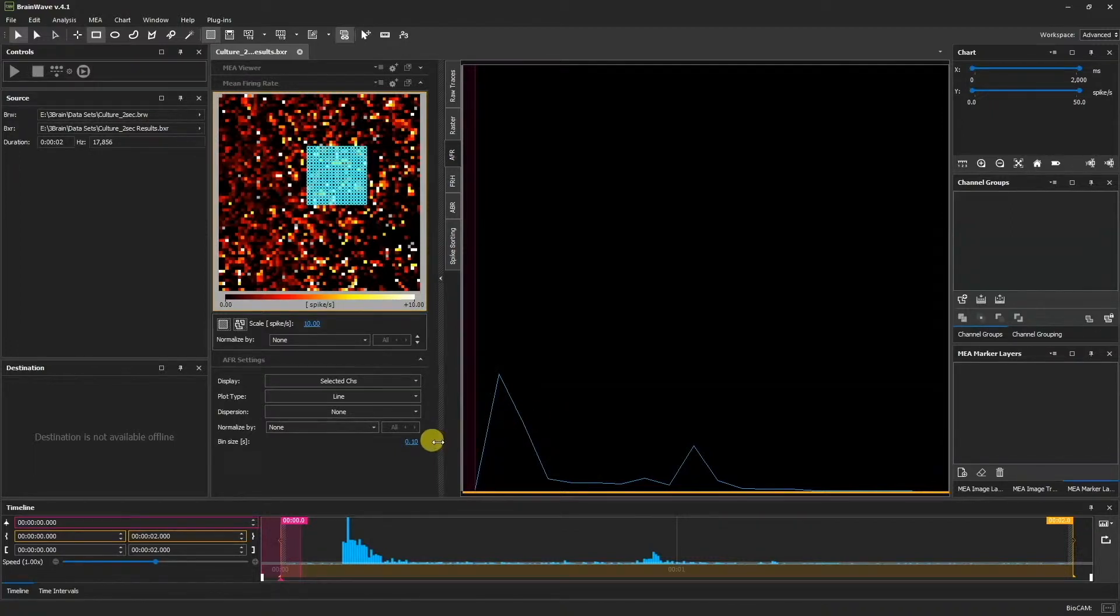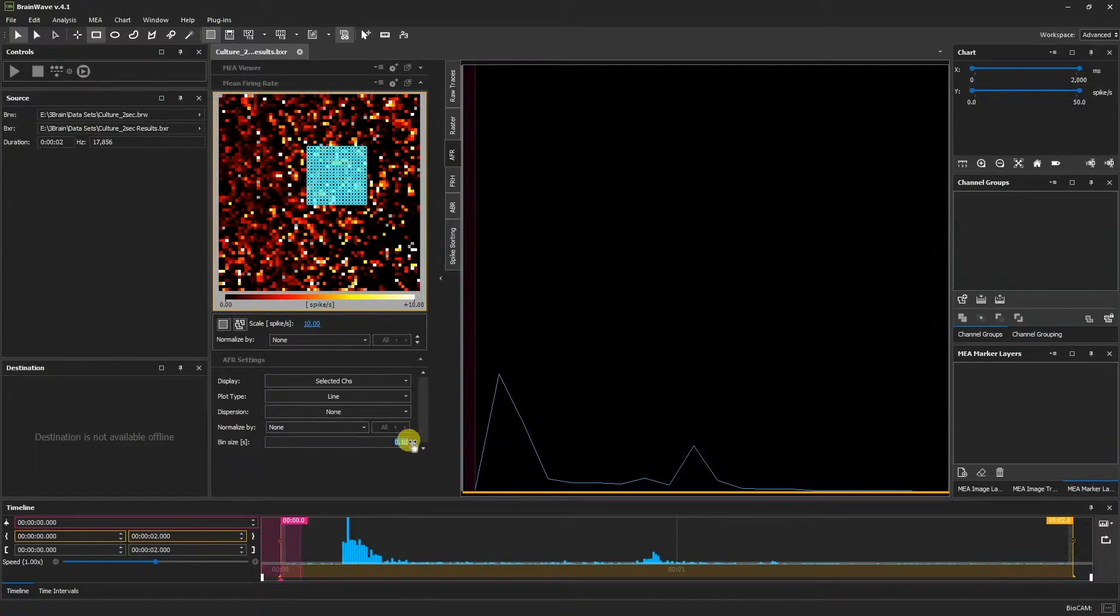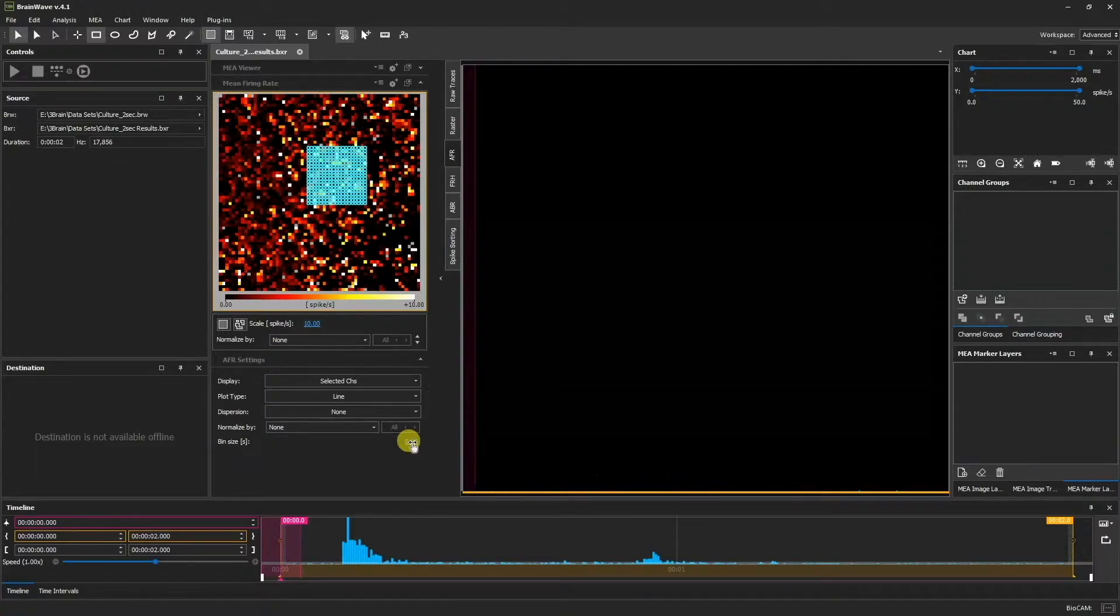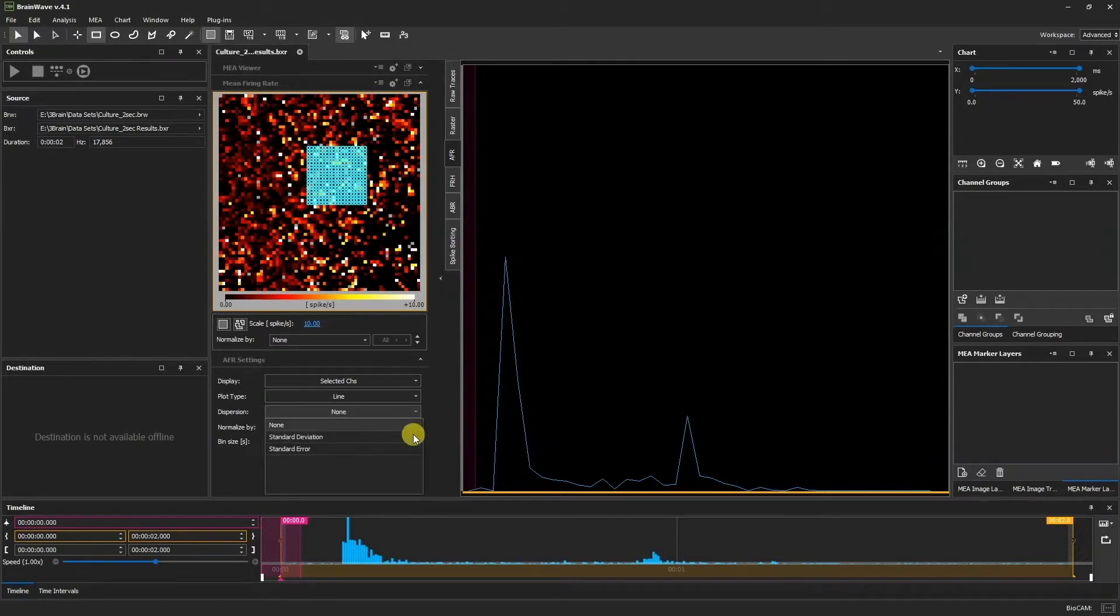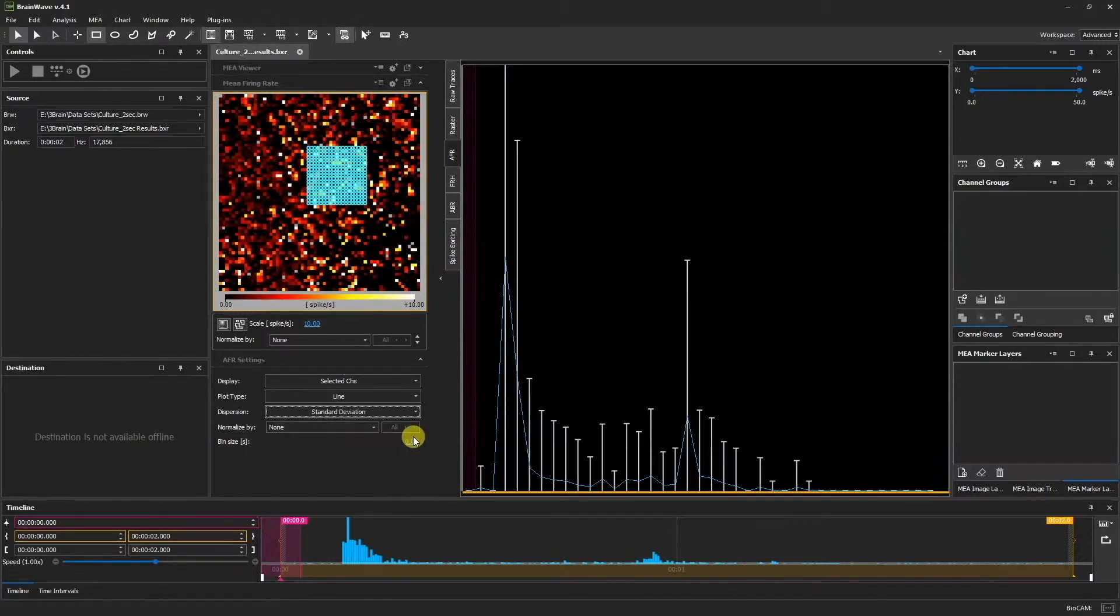In the AFR settings, we can control the bin size. Furthermore, we have the option to see the standard deviation and the standard error.